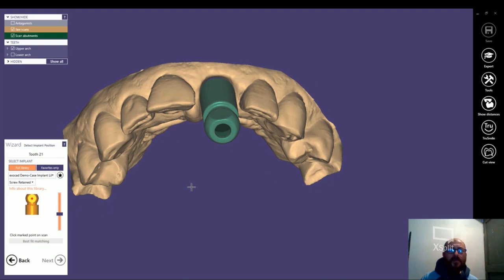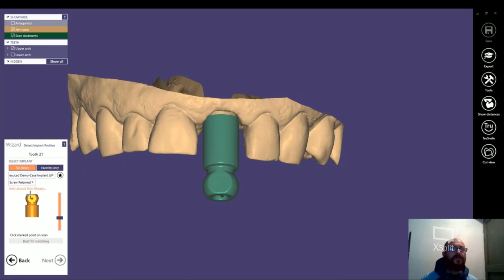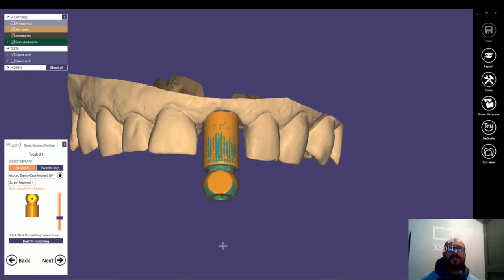As you know, when you acquire a scan body, the lower part of the scan body cannot be acquired perfectly due to the undercut surfaces, due to the neighbors, due to the gingiva, think about an intraoral acquisition and so on. So Exocad provides this feature so you can decide which part of the acquired scan body will be considered for registering the implant position. Then just pick one point as reported in this picture and press best fit matching.